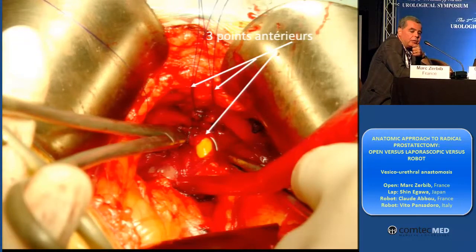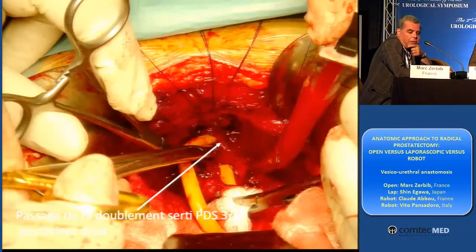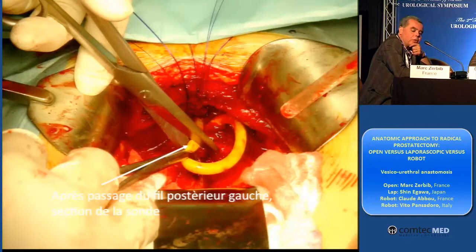And after I can retract the catheter and cut it. And as you can see, you see the posterior urethral wall.